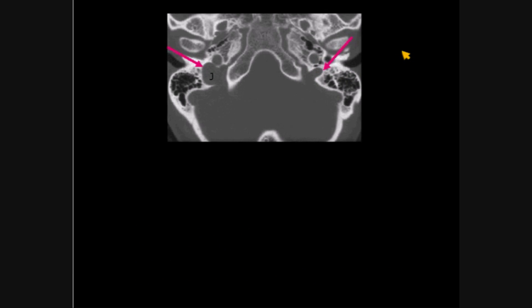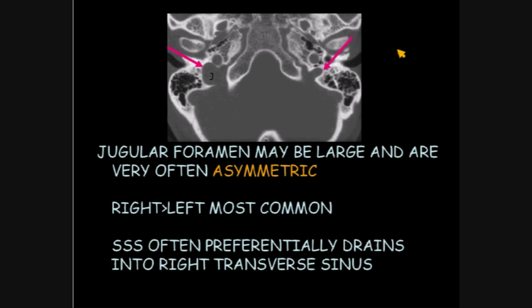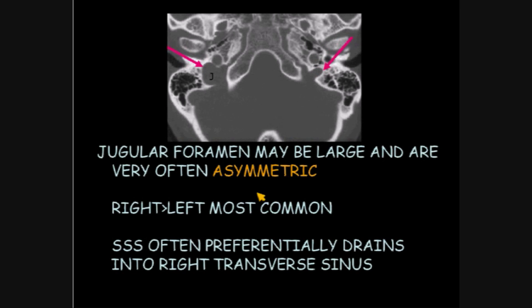The jugular foramen may be large and are very often asymmetric, even markedly so. Right is much more commonly large than the left. That's because the superior sagittal sinus preferentially drains into the right transverse sinus — that's why the right jugular vein is larger than the left, most of the time, but not always.